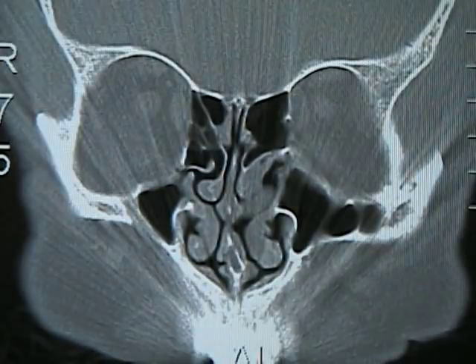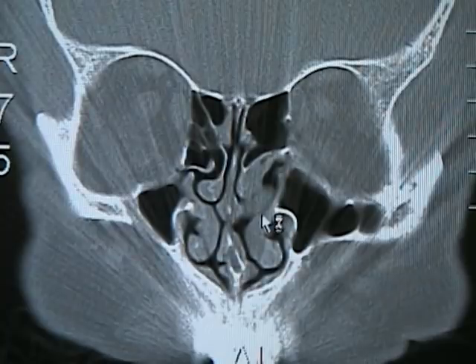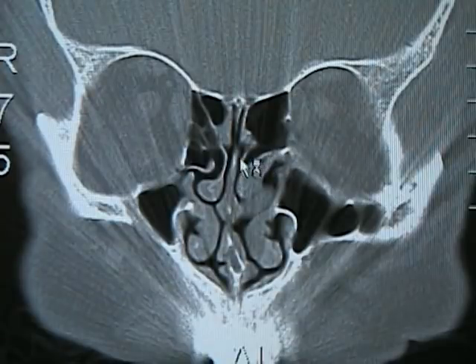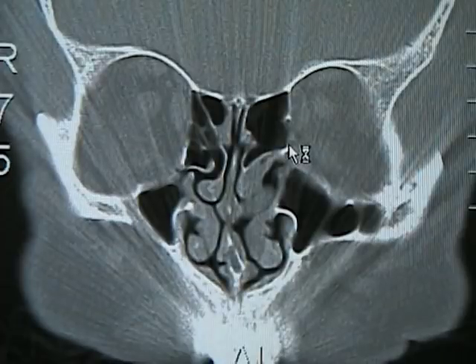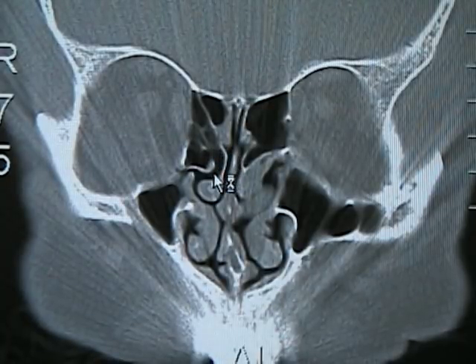As we travel more posteriorly you begin to see on the patient's left side a soft tissue mass representing the choanal polyp. Notice the mass appears to be underneath or possibly even attached to the left middle turbinate. One can see an extremely large unicellular or single-cell ethmoidal bulla on the left, and on the right side a two-celled bulla with a small opening medially into the middle meatus underneath the middle turbinate.